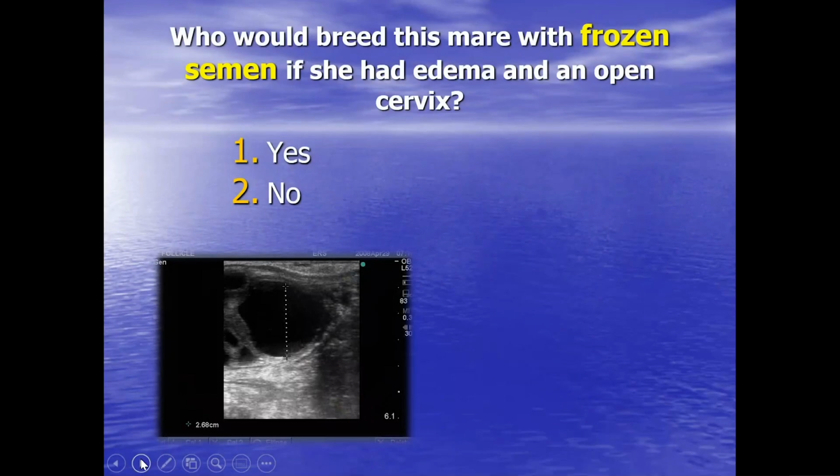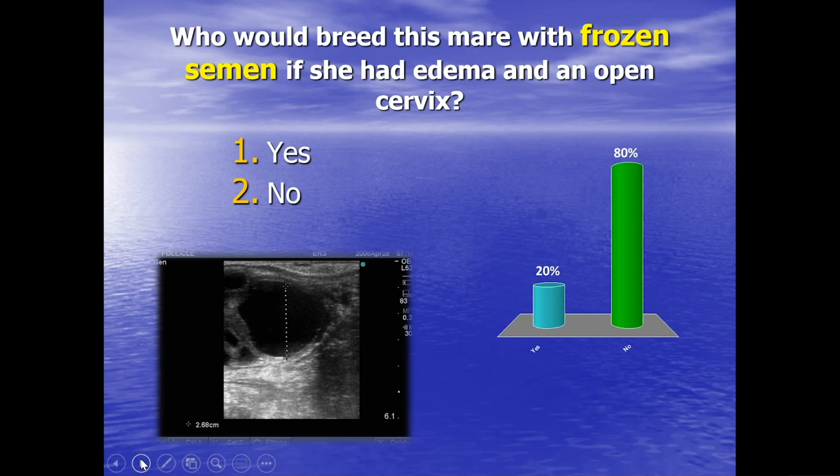Frozen semen, what do we think now? Who would breed this mare with frozen semen if she had edema and an open cervix? Well, this is good because I definitely would be in the 80% category. Why? Because the frozen semen's sitting in the tank.